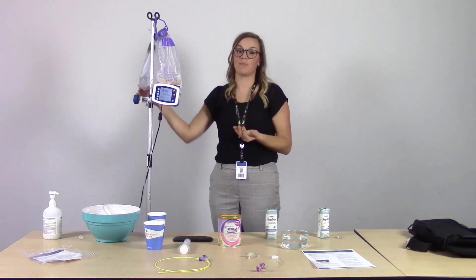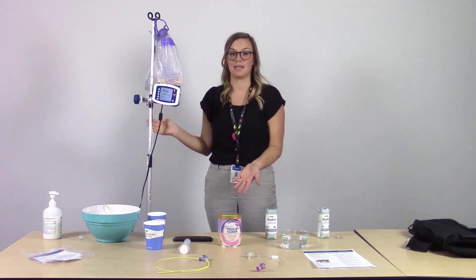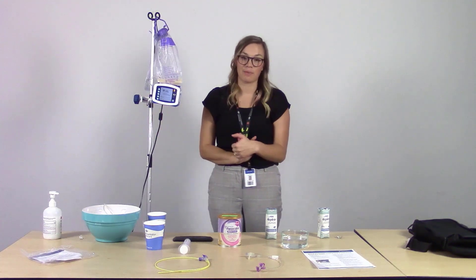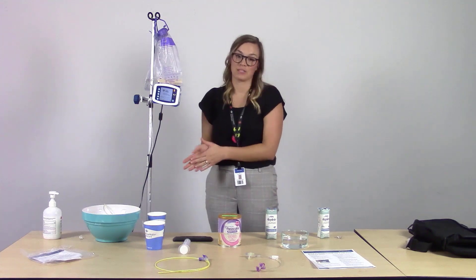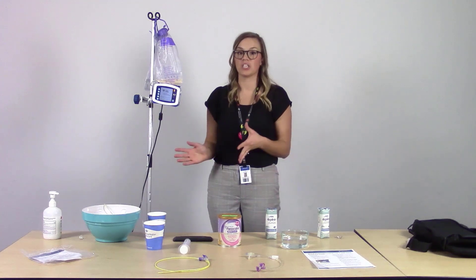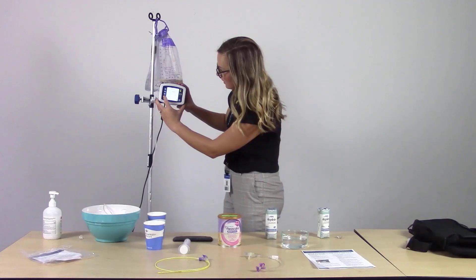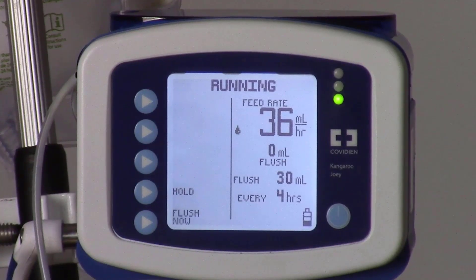At this time, you may need to replenish the flush bag as well, so please go ahead and do so. If you did disconnect from the patient, reconnect as we spoke of before — no need to flush in between since it's just a quick change out. Then press continue on the alarm, and since it's refilled, the pump will indicate running again and your feed will continue.